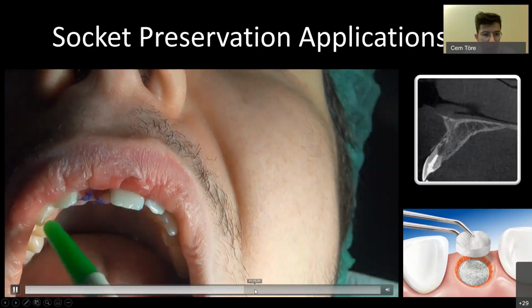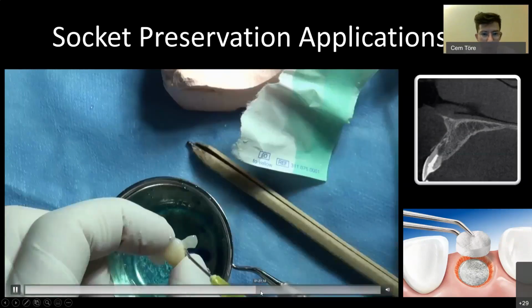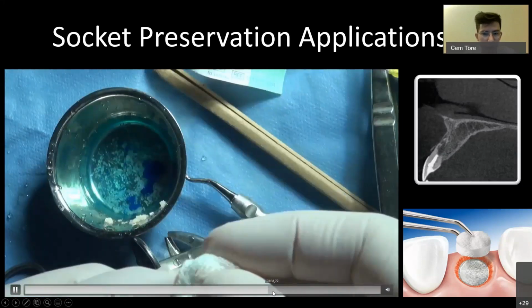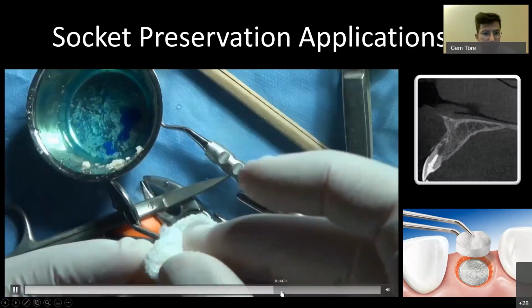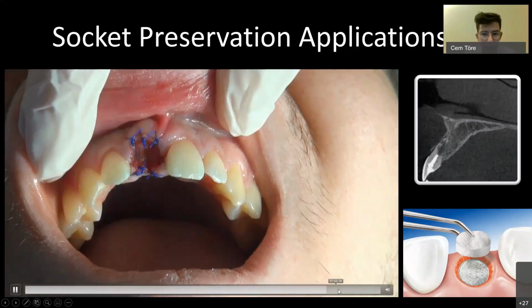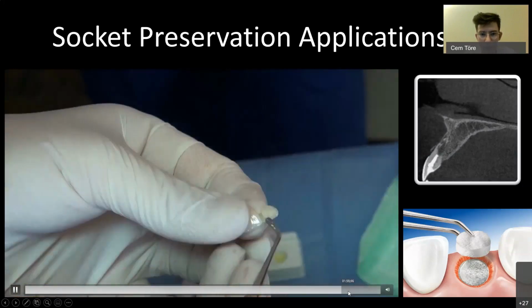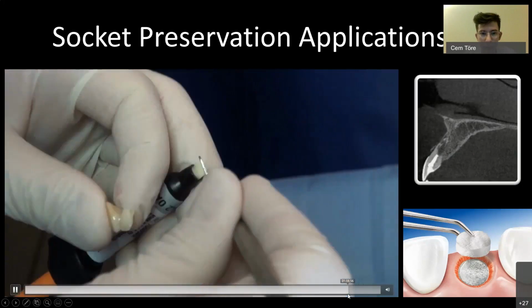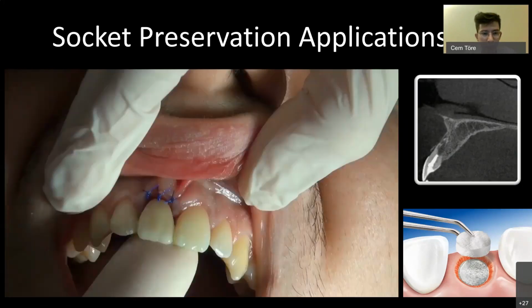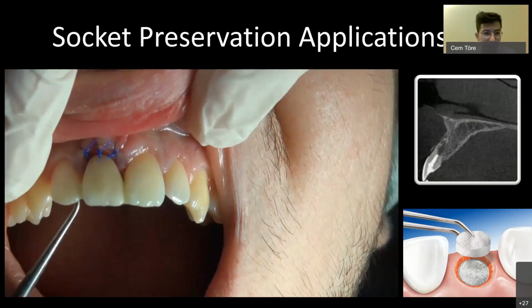We are preparing the site for the temporary prosthesis, the temporary bridge we have prepared beforehand on a cast model. And then it is bonded in place. If you have a color of composite you don't like, and it's always left over, this is your chance to get rid of that composite resin.